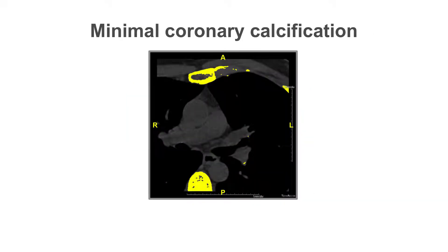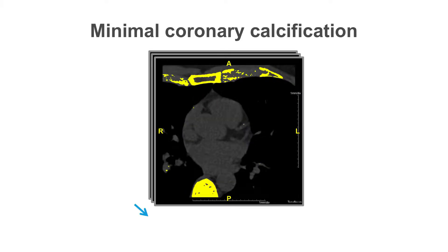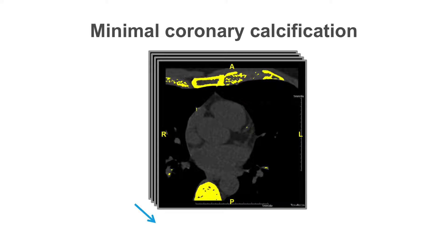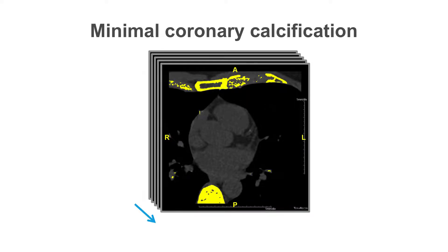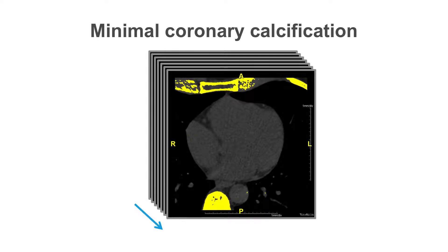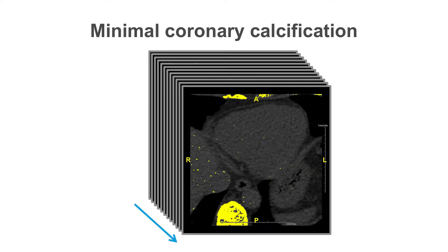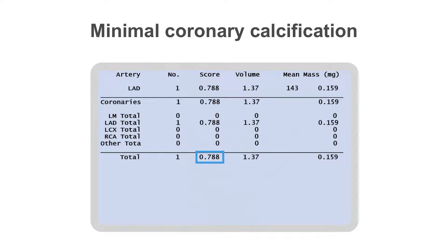Fortunately, every CT workstation has software that is able to calculate the coronary calcium score using this technique automatically. All that is required from the operator is to mark the calcified plaque within the coronary arteries. In this example, the software colour-codes anything with a Hounsfield unit score above 130, which represents calcium. There is only a tiny amount of calcium in the proximal LAD segment, and the total coronary calcium score was 0.8 Agatston units.